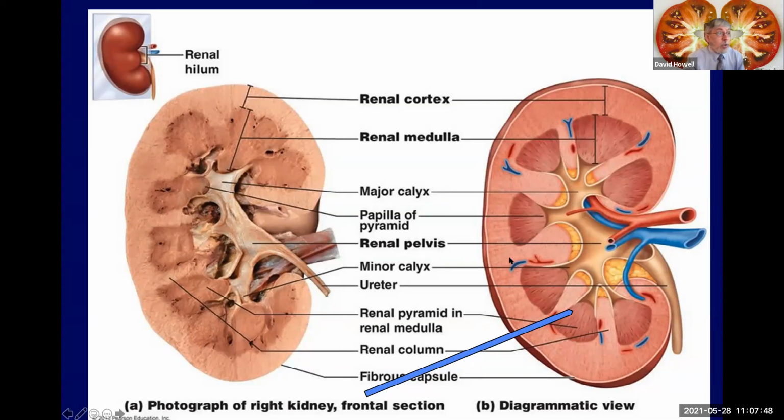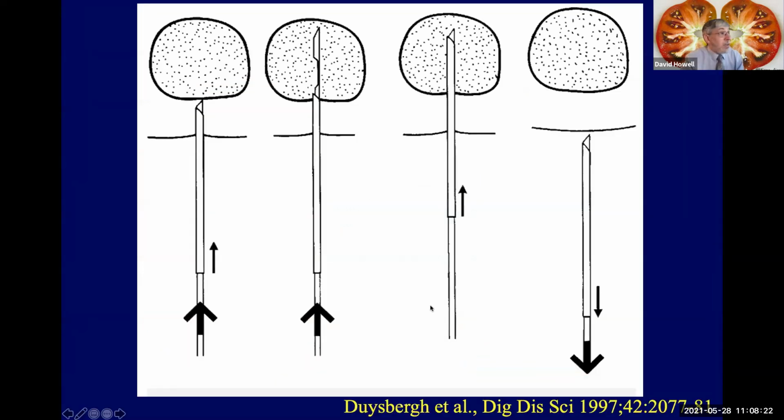And here's another cartoon of the same cross-section of kidney and a stylized biopsy device that has been placed through the surface of the patient's skin and into the kidney, and it's gone through cortex and into medulla here. Now, you would think that if you're pushing a trocar into the kidney, it has to go through the cortex, and so any biopsy taken in this way would automatically contain cortical tissue, good for diagnosing glomerular diseases. The trouble is the biopsy devices in use today don't work that way. They're more complicated than that.